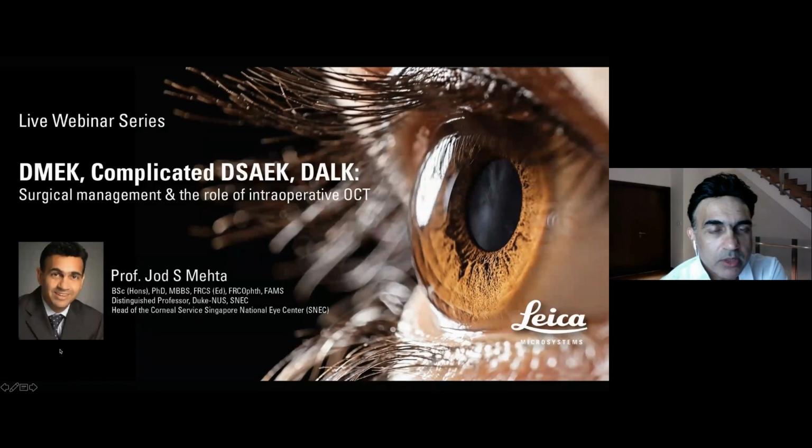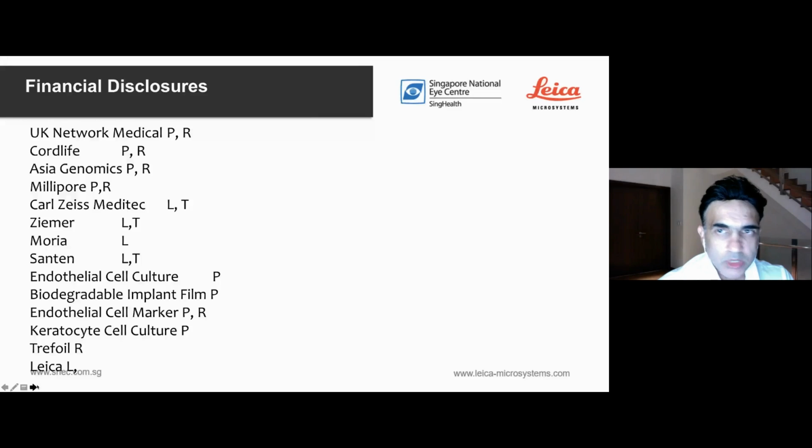We're going to be talking about DMEK and some complicated DSAEK surgery and surgical management, really focusing on the role of intraoperative OCT in these surgical procedures. These are my financial disclosures. They pertain to some of the instrumentation that you will be seeing on how to do the surgery.